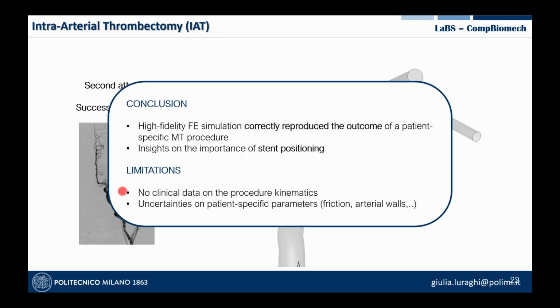So to conclude, with this final application, we built a high-fidelity finite element simulation to correctly reproduce the outcome of a patient-specific thrombectomy procedure. We also showed how important it is to correctly model the stent position and the impact of the stent position on the outcome of the procedure itself.